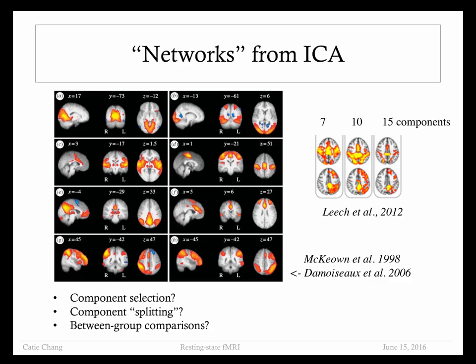But even though we're just using this blind mathematical criterion for finding the components, it gives us really realistic looking functional networks, and it does this with quite high reliability. And so this comes from running ICA on a group of healthy subjects, and you see familiar networks, visual network and default mode network, for example. And these are usually consistent with results of seed-based correlation on some level, which makes sense because even though there's not really a straightforward mathematical relationship between these methods, both of them tend to converge on areas that share really similar time courses with one another, which these patterns do pretty robustly.